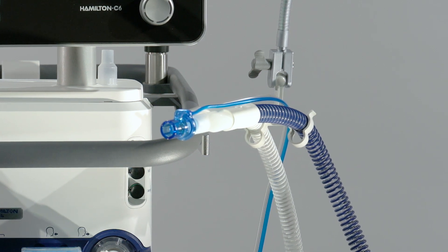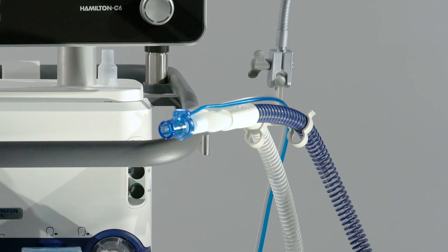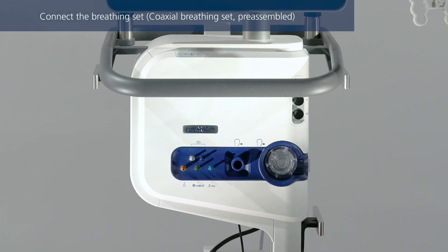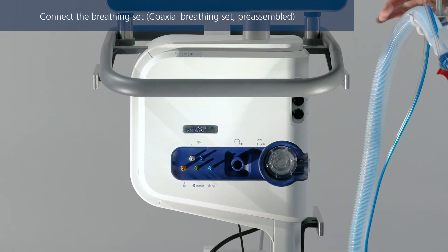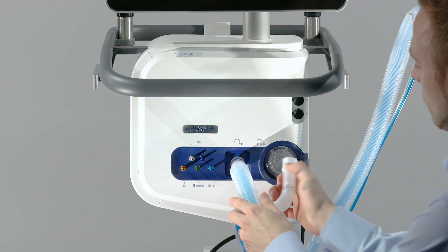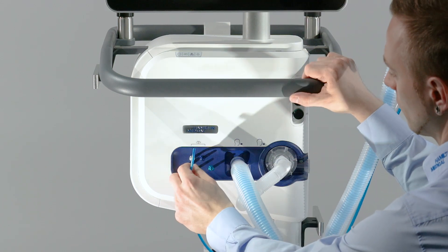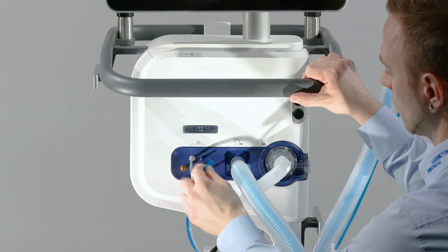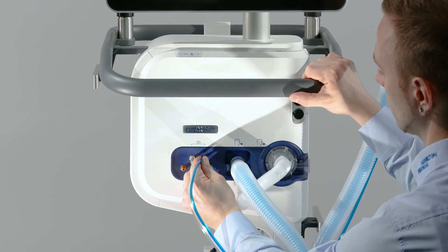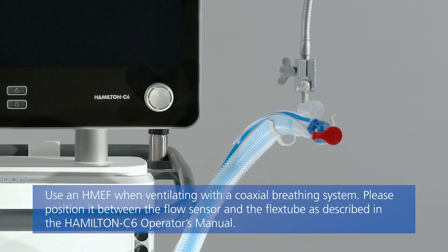To prevent water accumulating in the flow sensor and tubing, position the flow sensor tubing on top of the flow sensor. The gas temperature is measured at the Y piece by means of the temperature probe integrated in the inspiratory limb. Keep the inspiratory limb positioned correctly. If you are using a coaxial breathing set with the proximal flow sensor, first connect the main tube to the inspiratory port on the ventilator. Then connect the expandable expiratory tube to the expiratory valve. Finally, attach the blue and clear tubes to the flow sensor connection ports on the ventilator, and position the flow sensor tubing on top of the flow sensor to prevent water accumulation.